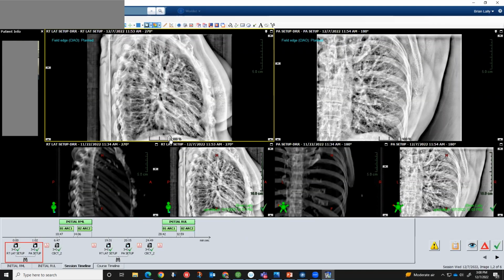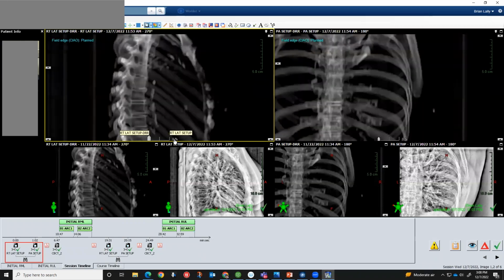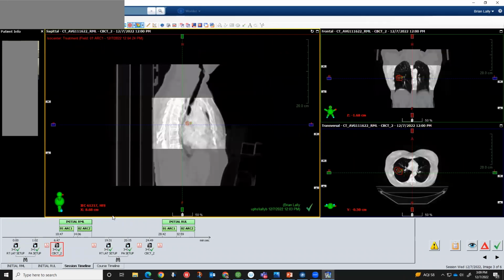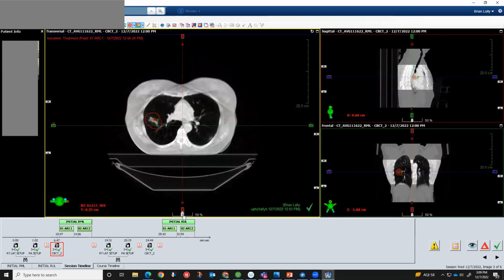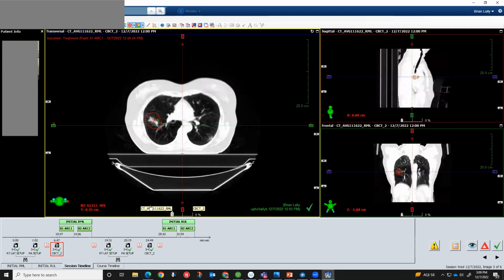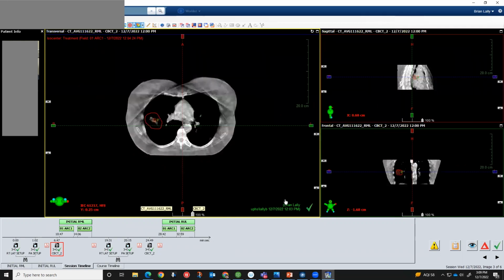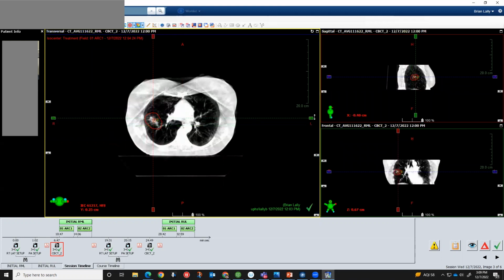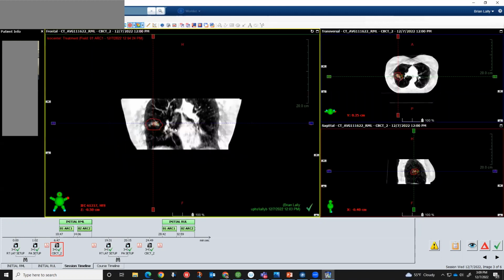When we go to treat the patient, the first thing we do is obtain plain films or x-rays called KV, and we make sure that all the anatomy is lining up. Then we do a quick CAT scan, as you can see here, and we want to make sure that this cone beam CT that we're obtaining right before treatment shows the same anatomy as when we planned the patient. Let me highlight this a little bit better. It looks like that is lining up perfectly. And I also like to look at it in all 3 dimensions just to make sure that everything is spot on and perfect.